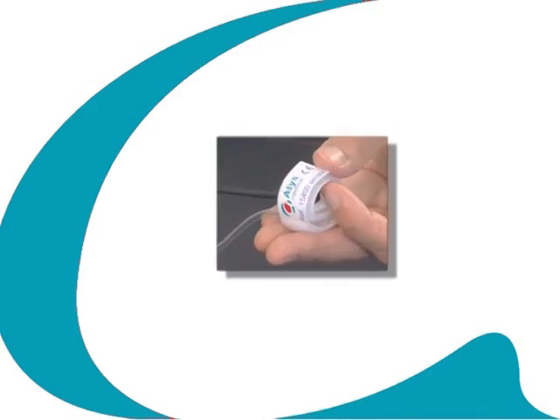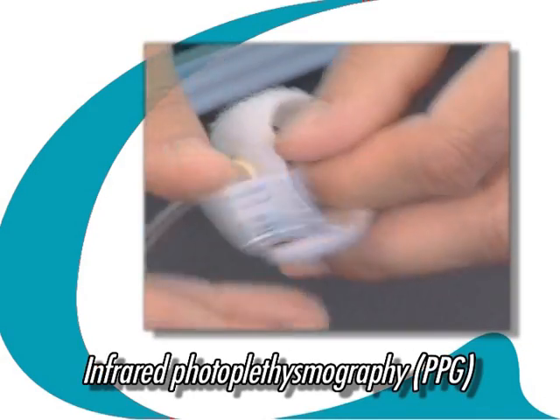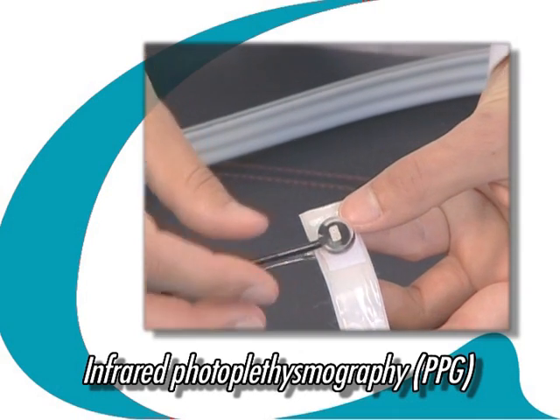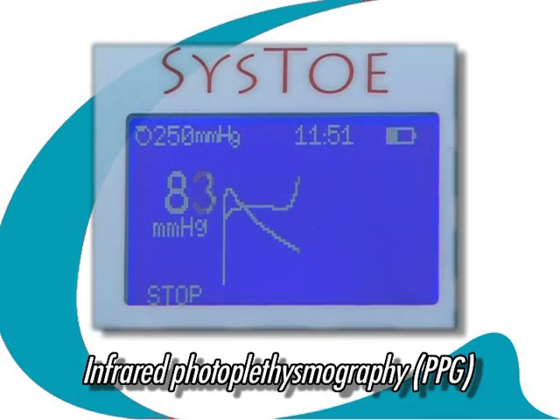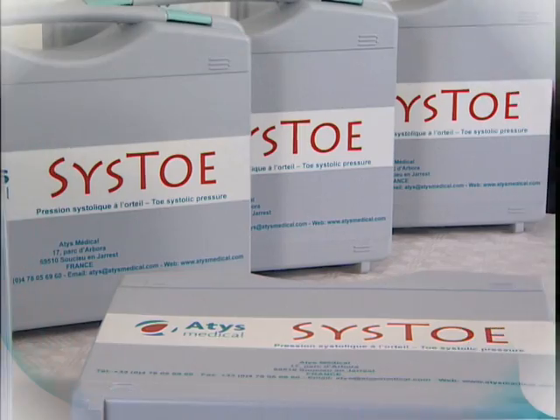The SysToe represents an ingenious application of infrared photoplethysmography, PPG, coupled to a unique algorithm developed and patented by Atys Medical. By means of a photoelectric cell, PPG detects changes in blood flow in the vessels of the skin.